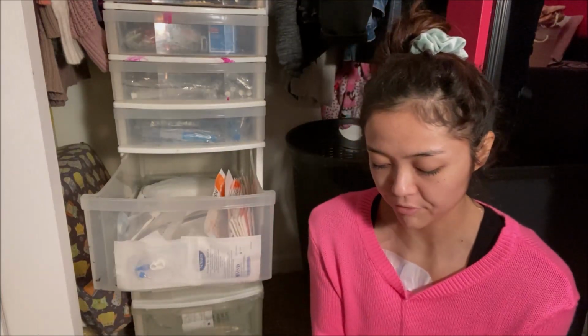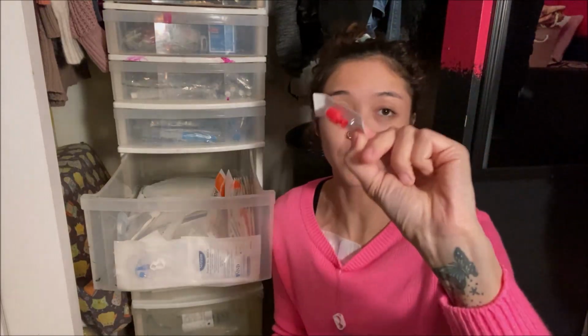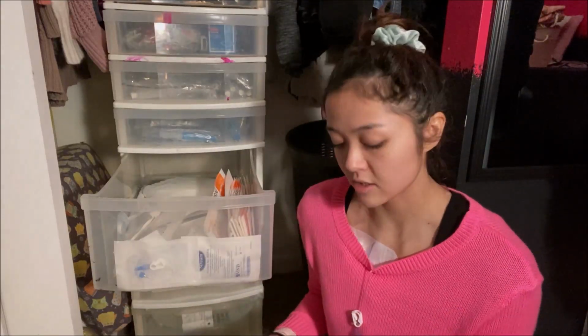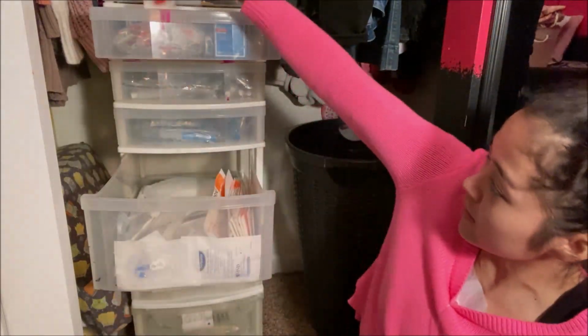And then these I use, so I drive for Uber, so if I'm working while doing infusions, there's a little pocket behind my driver's seat, and I put my infusion bag back there, and then I hook it around my seat as well. Since it's kind of secured there, it's very hard to take breaks and go to the bathroom and then try to secure it all again. So I just hook one of these at the end of my infusion line, and then I put a green cap at the end of my central line, and voila, I don't have to take the bag into the gas station to go to the bathroom. Things like that. That's what these are helpful for. And I put all those in there.